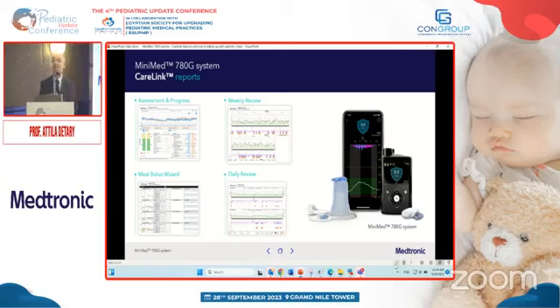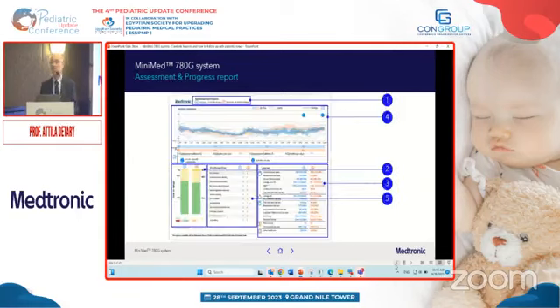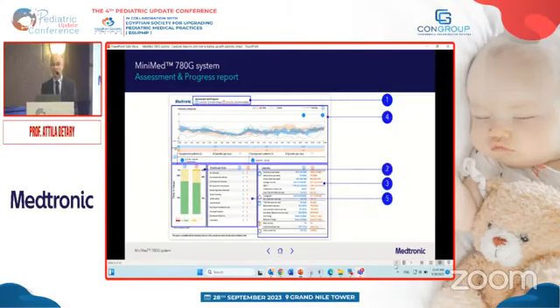data. So in the system, we have 7 different types of reports. So it's a wide choice, depending on what you want to check and from what aspect you want to see the treatment. So the most important report is the first one. That's the assessment and progress report. There are different parts of the report. So on the top, as you can see, number one is the period you selected. So when you generate the report, you select usually the last 2 weeks and the reference period.